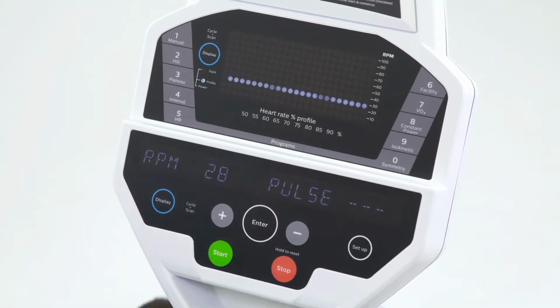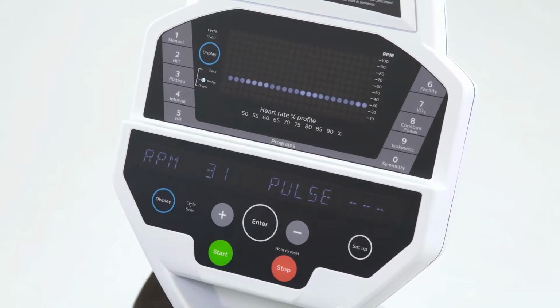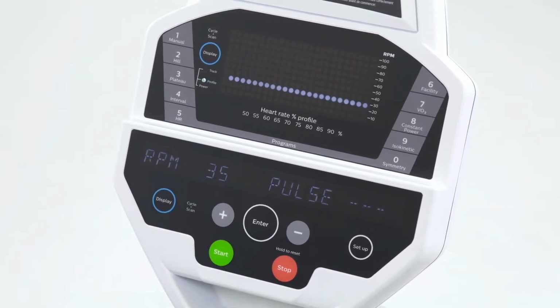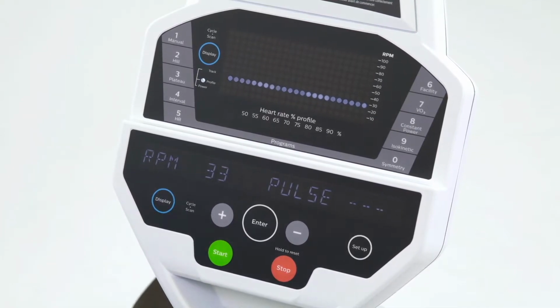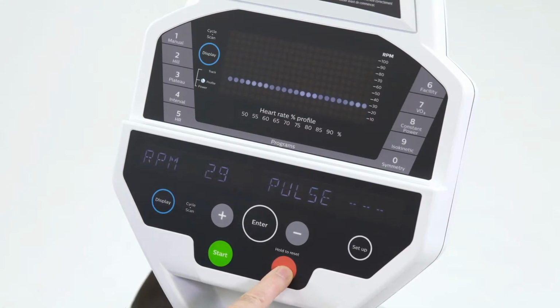set to 30 RPM, so below 30 RPM, I'm at 28 or 29, I get no resistance. Once I hit that 30 RPM, that resistance starts to increase, and I can push against that resistance really hard and increase my power without overcoming the speed. So those are the 3 different modes of resistance.